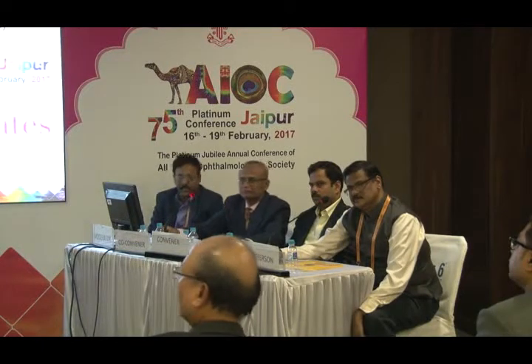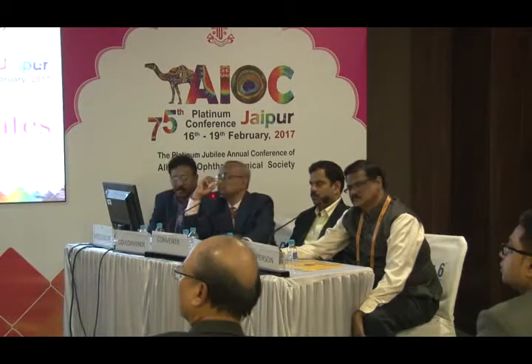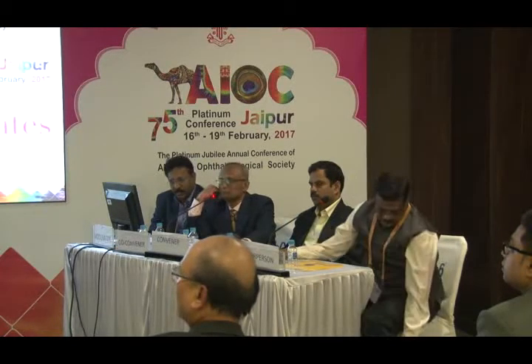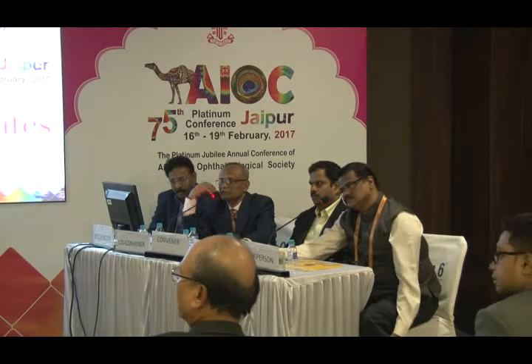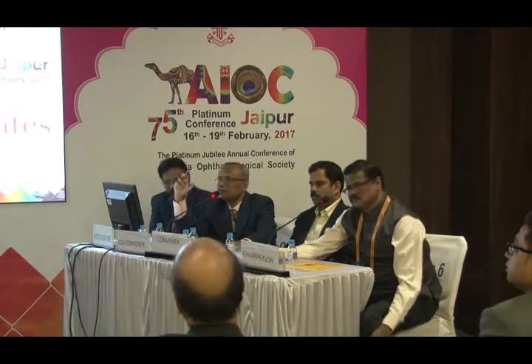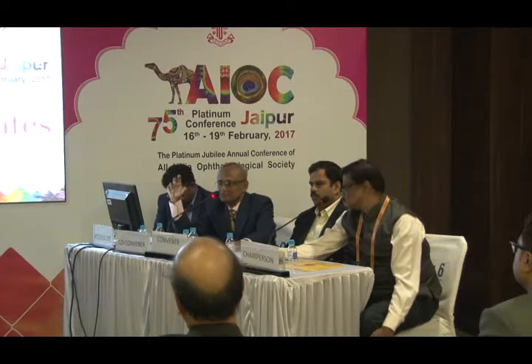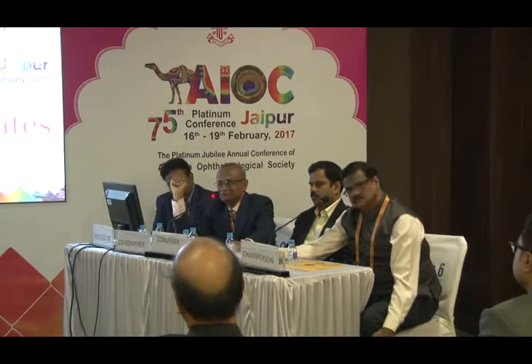Because it's moist steam inside. Because water is there, it becomes steam, and the steam is mixing with vapor. There's nothing called a vacuum at all there. What you can do is let out whatever air is there on top, but it's not 100%. Actually, steam should be 97% dry. Only 3% moisture is allowed inside steam. In a vertical autoclave, it is all wet. It is not dry steam.